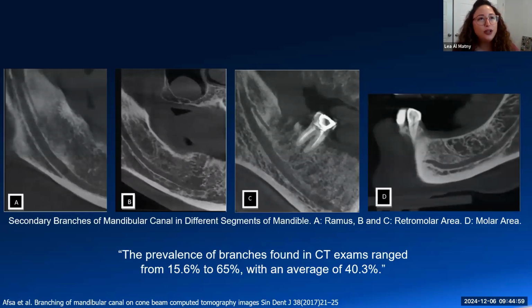Now, I would have loved to ask you, how often do you think you see secondary branches?